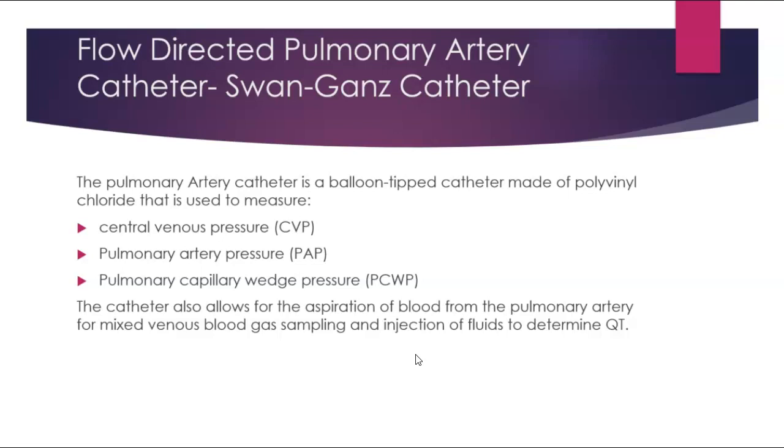The other great function of these catheters is that we can also aspirate blood from it, and we can do assessments on mixed venous blood sampling. We can give fluids. We can determine your cardiac output. So these catheters are really fabulous at giving us a lot of information.